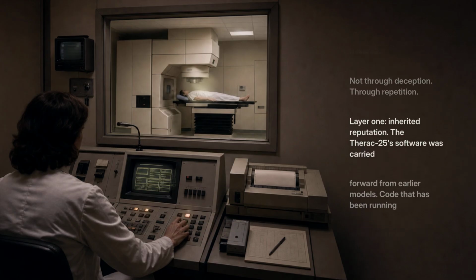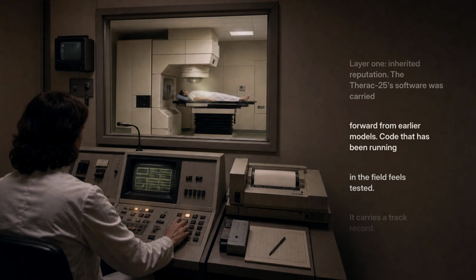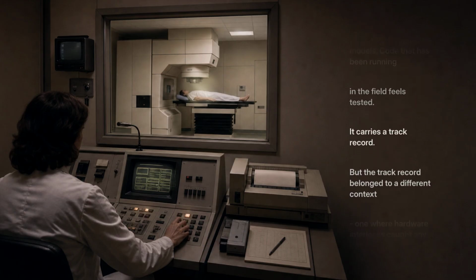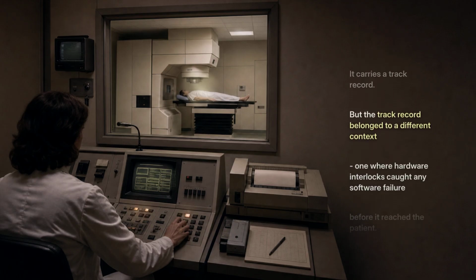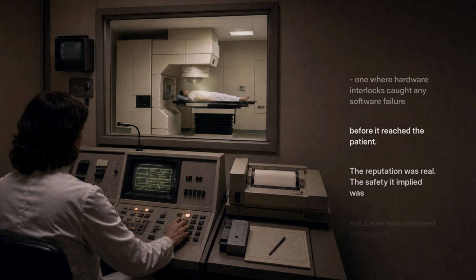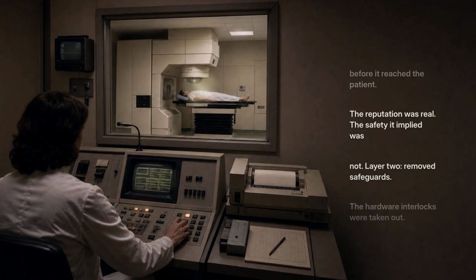Layer 1. Inherited reputation. The Therac 25's software was carried forward from earlier models. Code that has been running in the field feels tested. It carries a track record. But the track record belonged to a different context, one where hardware interlocks caught any software failure before it reached the patient. The reputation was real. The safety it implied was not.